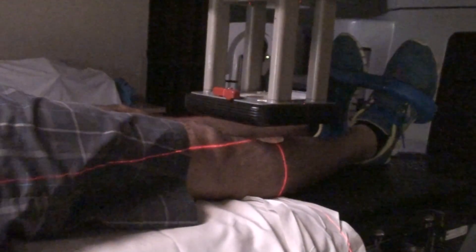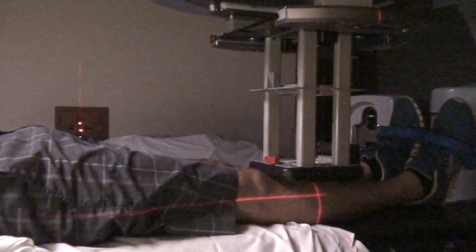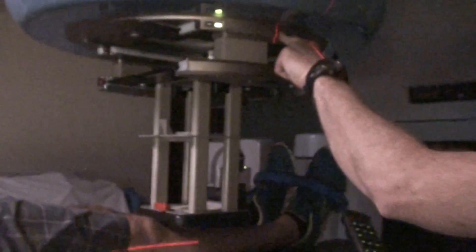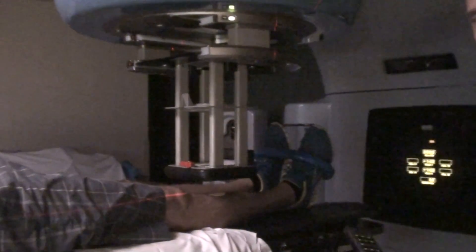If I haven't already demonstrated the collision ring to you, this is how it works. If you run up — say you've got a student that's not paying attention, talking to their classmate — boom, we just hit our patient. The collision ring means I can no longer impale the patient. To recover, you have to hold the red button and then go down. Make sure you don't hold the red button and continue going up — that would be a negative.